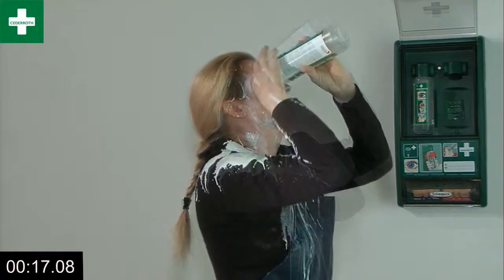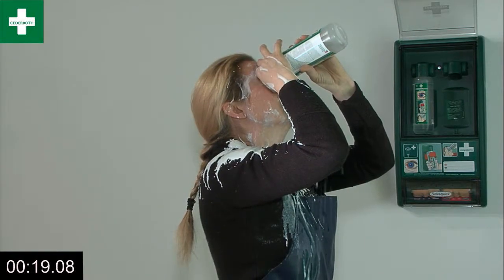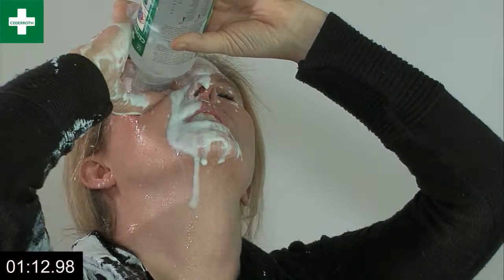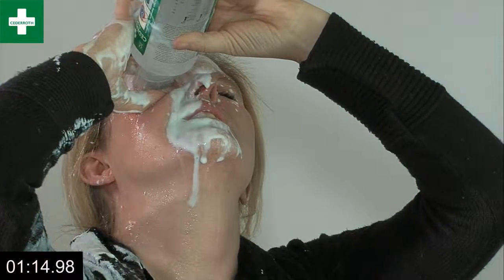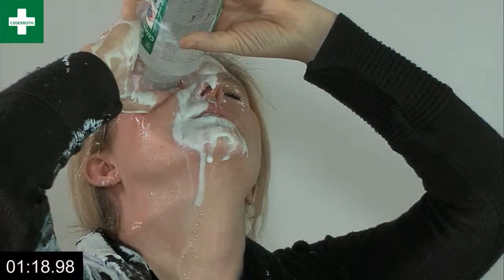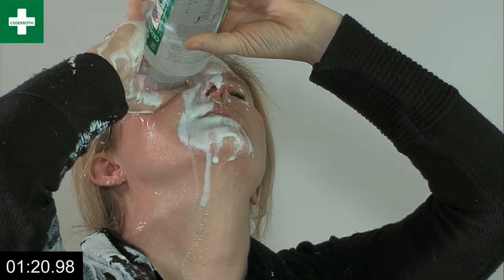Use thumb and forefinger to keep the eyelids apart. It's important that the liquid can flush clean everywhere. Continue flushing for several minutes to ensure that the eye is completely clean.